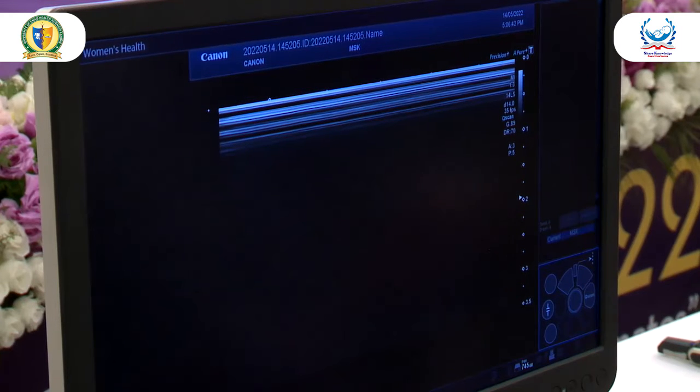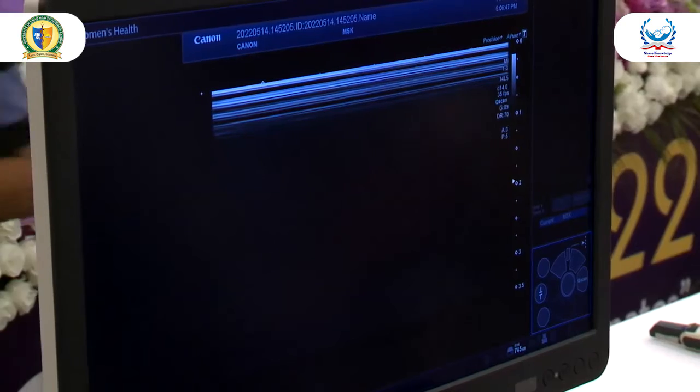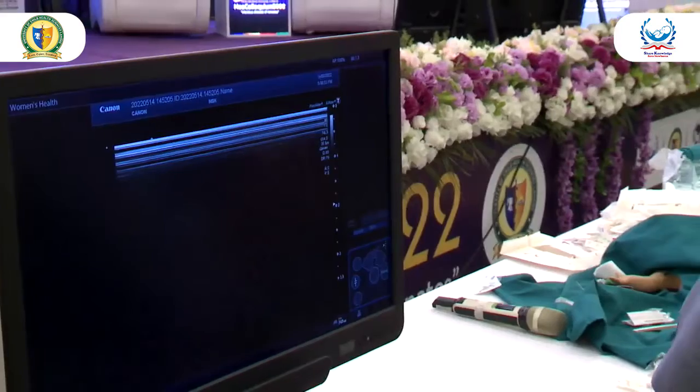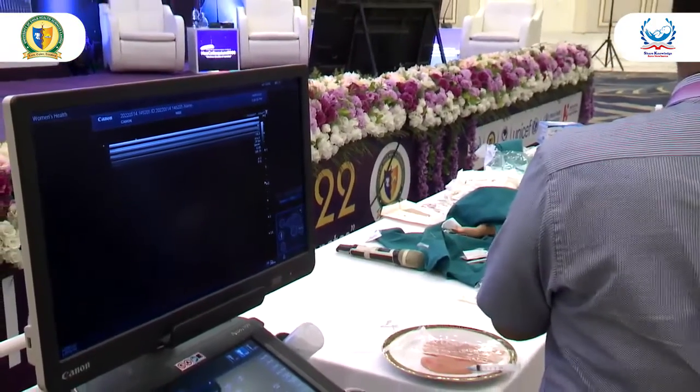An important aspect which I forgot to mention earlier is that whenever we are doing an intervention with the help of ultrasound, we have to make a sterile field. Nowadays, there are probe covers available in the form of a long sheet which can be placed over the whole length of this probe and its wire, and you keep yourself in a sterile plane. They are very easily available in the market right now. Through them, you first take your aseptic measures and then just place a probe cover over the probe, and you can use it as many times as needed.